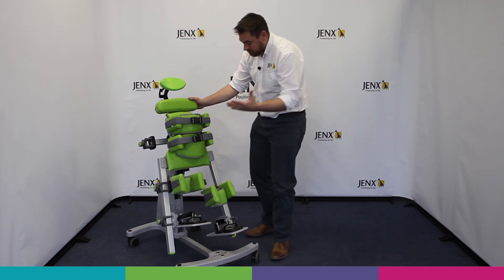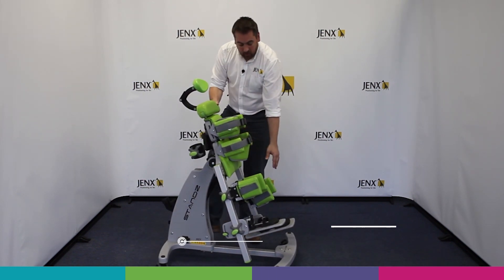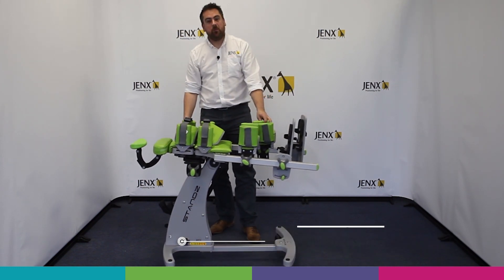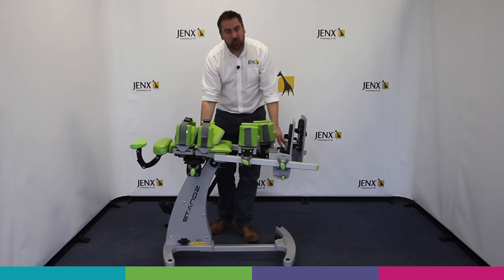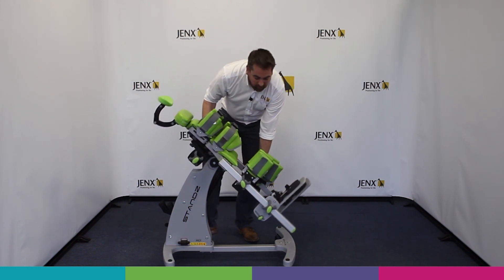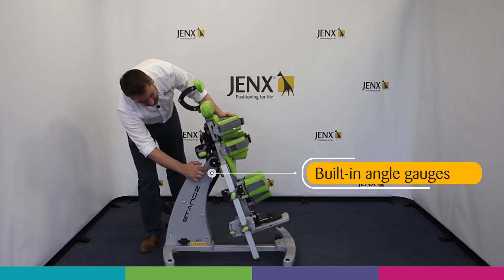When we're coming to get those children in and out of the product, we can see that it's very easy to lie Stands in a horizontal position, so it makes those transfers in and out very simple, safe, and dignified. We can then come through to whatever our desired standing position is.